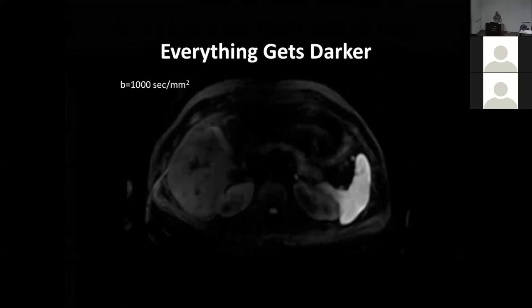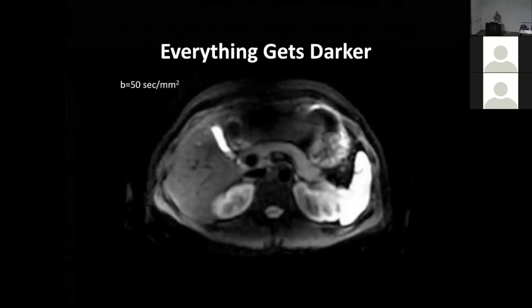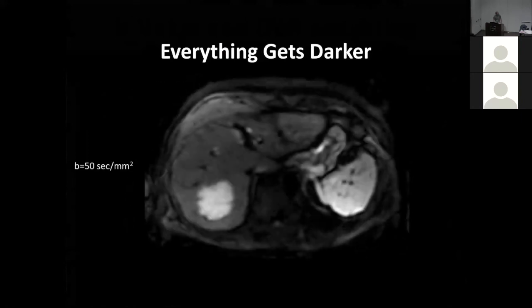Even the spleen got darker. The spleen is darker here than it was here. You just maybe can't tell so much because the spleen is only a little bit darker, whereas, for example, the fluid in the gallbladder and the CSF are much darker as the b-value goes up.